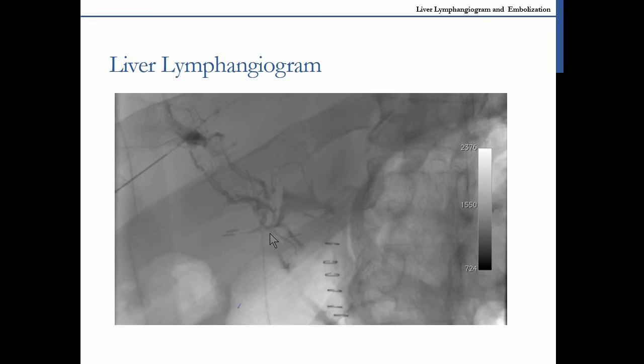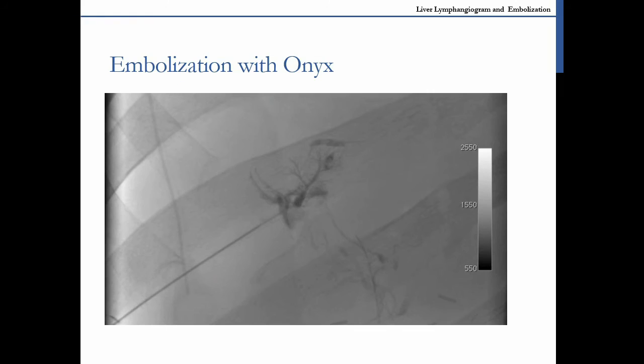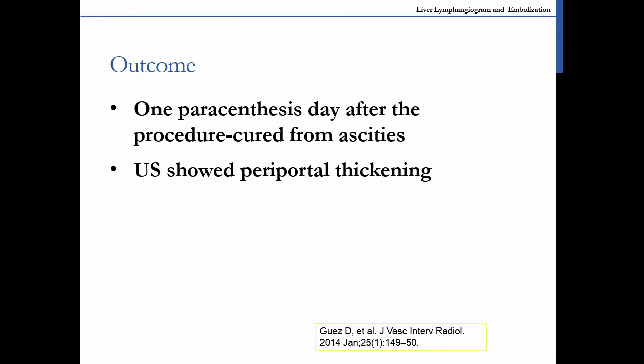The moment we glued them, we used Onyx at the time, he had only one paracentesis and was cured of ascites.